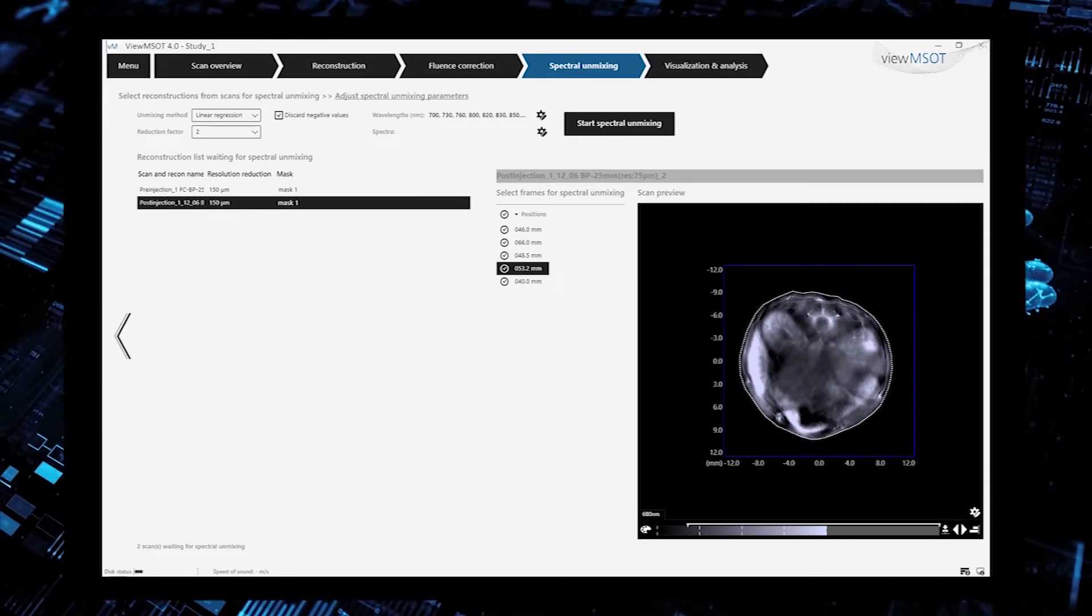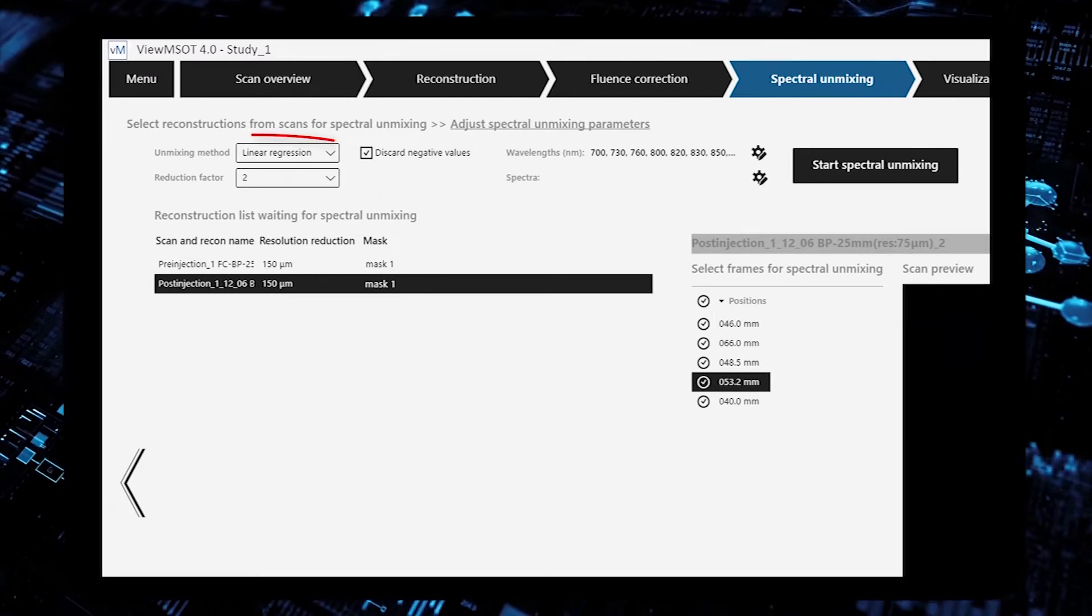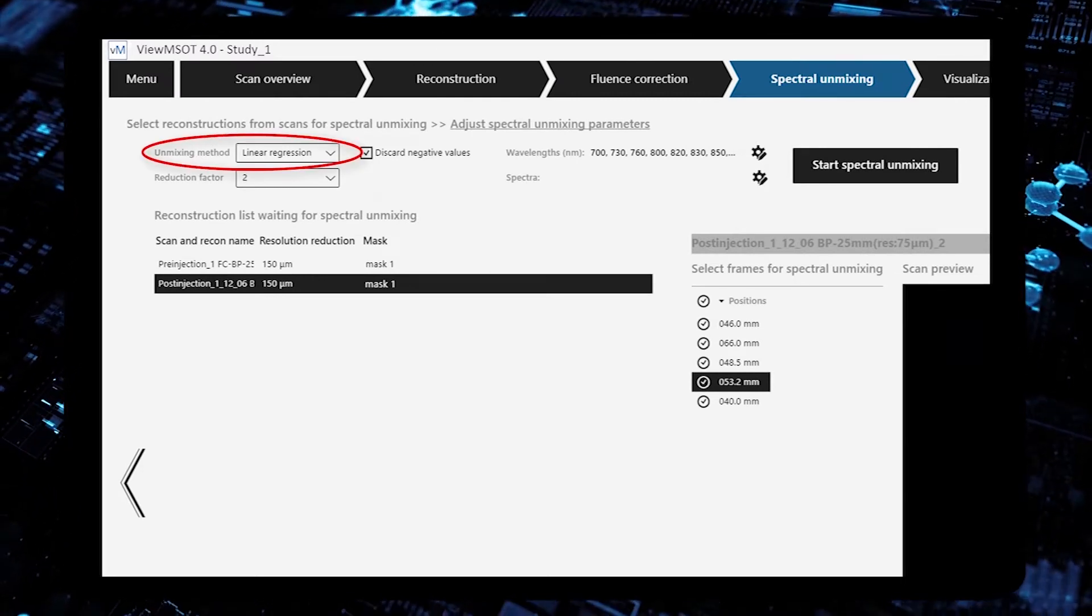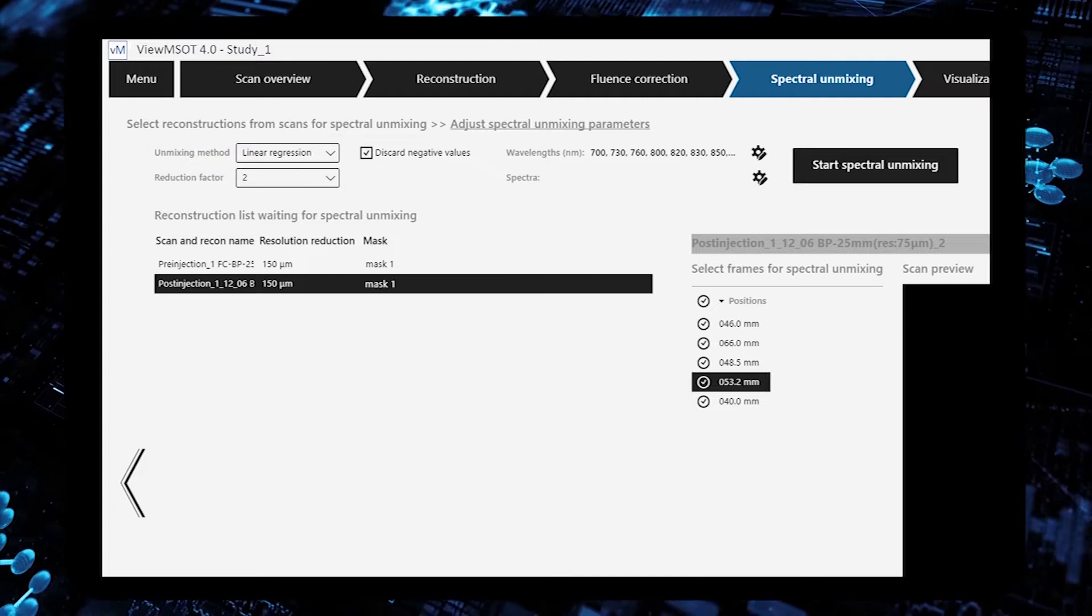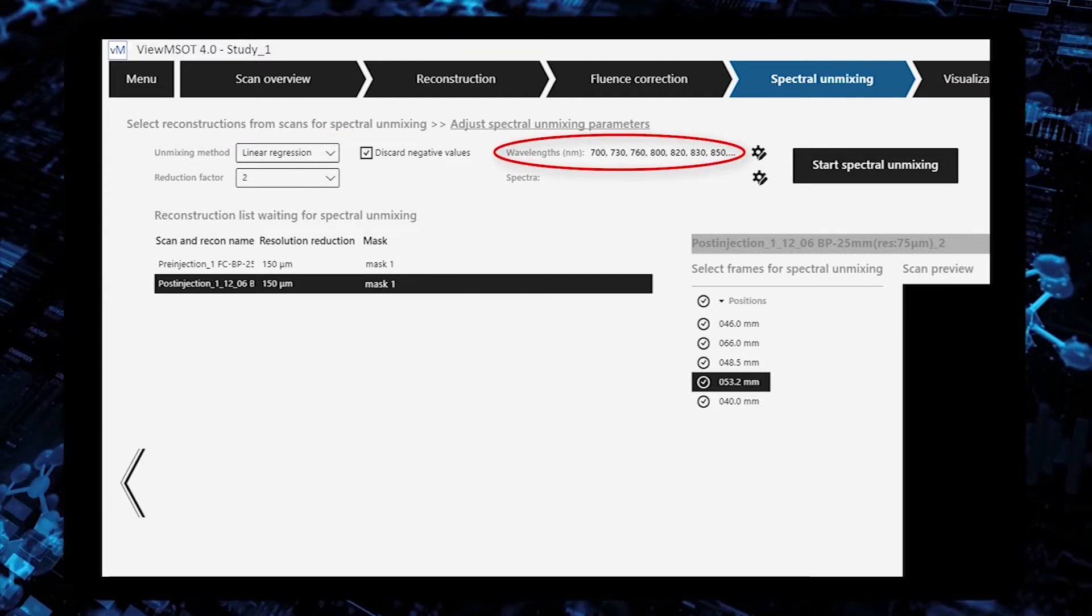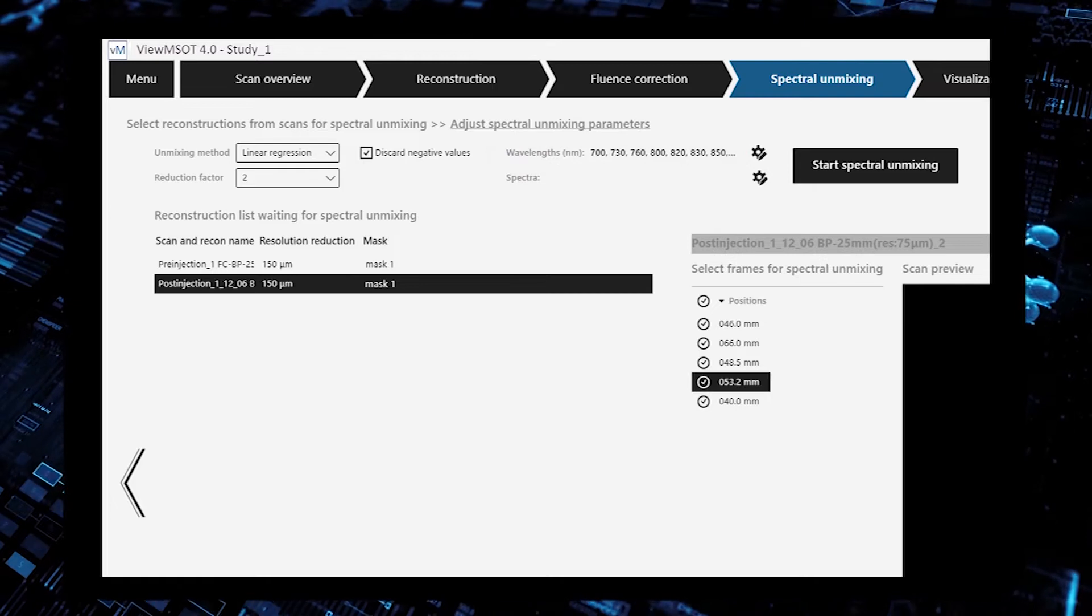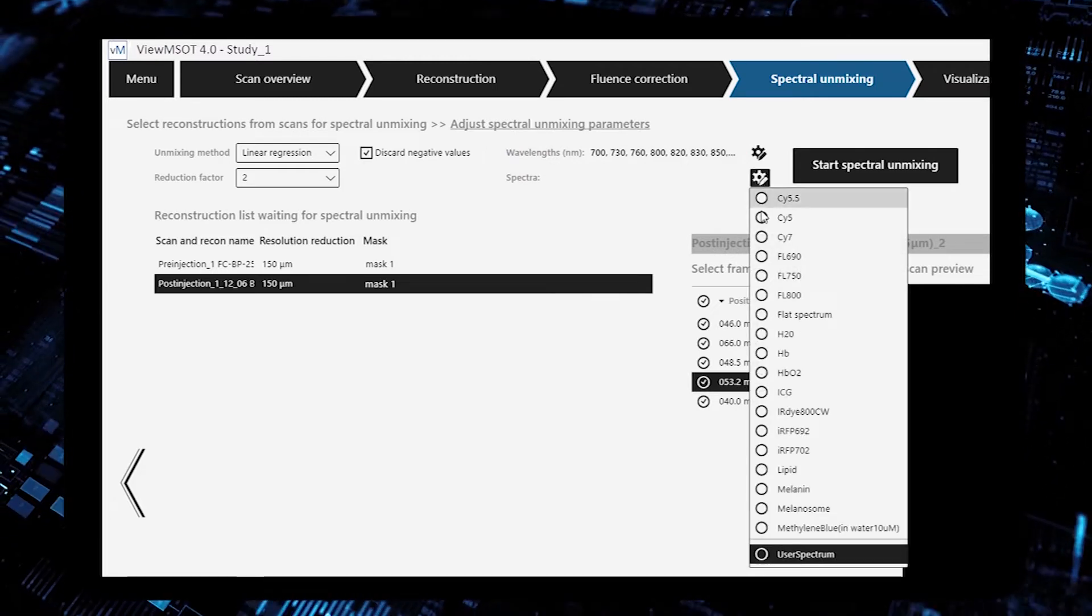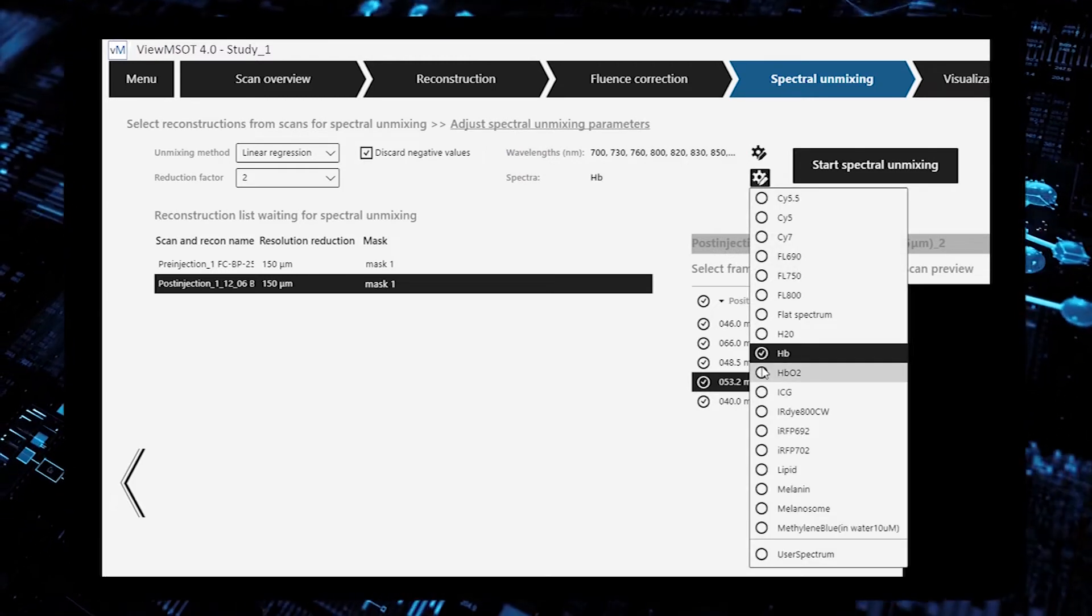To define the analysis, the user picks the appropriate unmixing method, wavelengths to be included, and the chromophores for analysis.